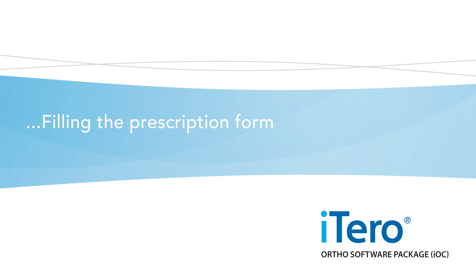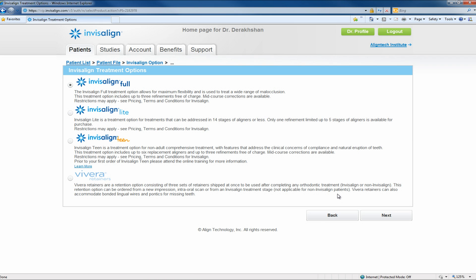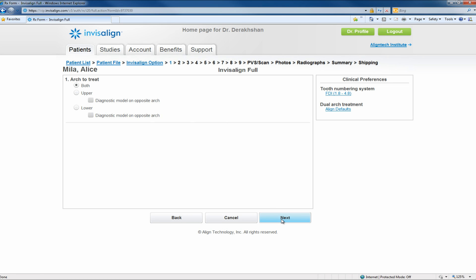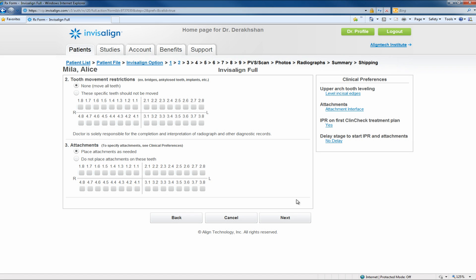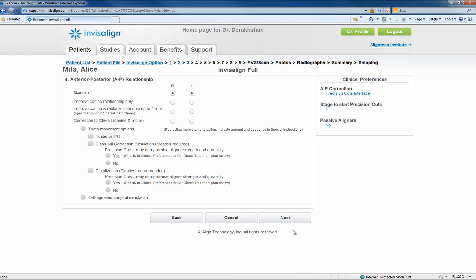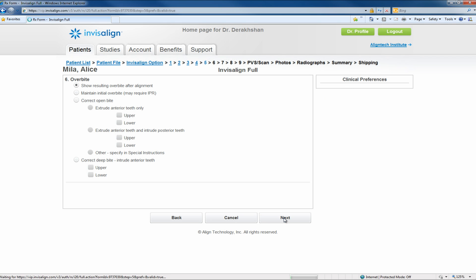Filling the prescription form. The second way to enter a scan is by filling out a prescription form if you have already created the patient on the Invisalign doctor site before taking the scan. The consecutive pages are questions 1 through 9 about the treatment goals for the patient. Each question will provide a line with instructions on how to achieve the desired treatment goals. Details such as anterior-posterior changes, overjet, overbite, and midlines, as well as instructions on how to achieve these goals, are requested on these pages.